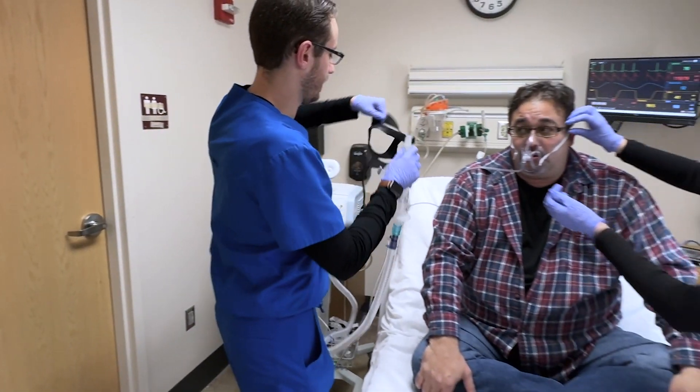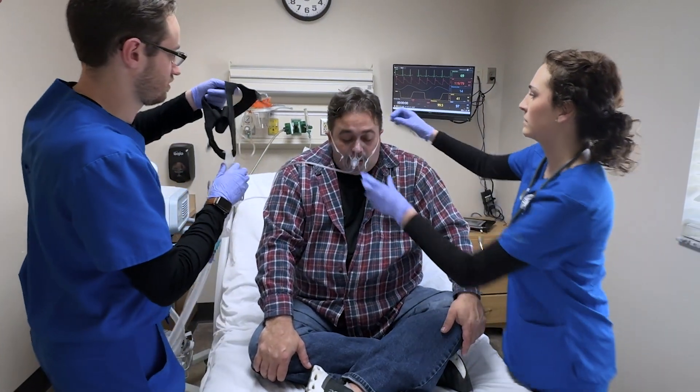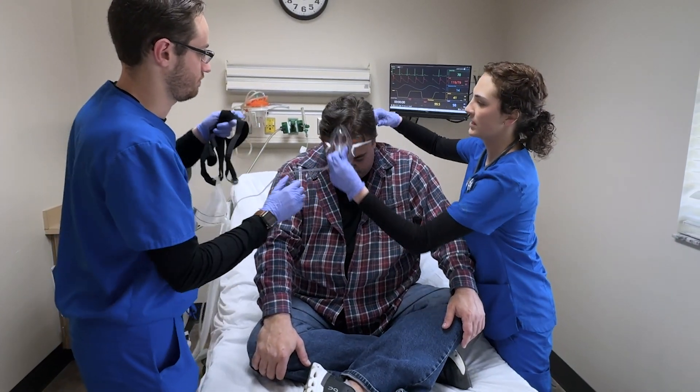Alright, we're going to put this mask on you, okay? It's going to help push the fluid off of your lungs. It's going to help you breathe better. We're just going to take that off too.